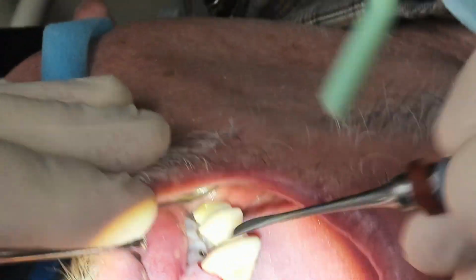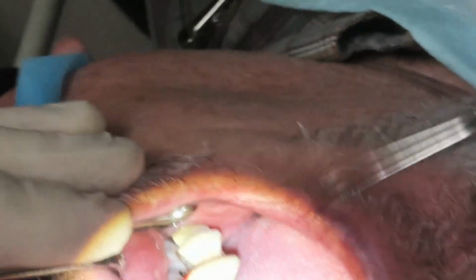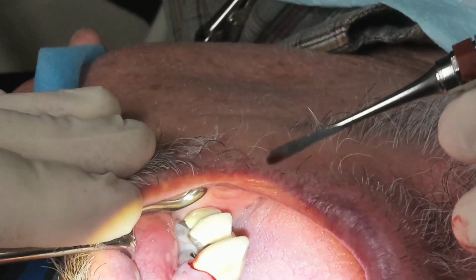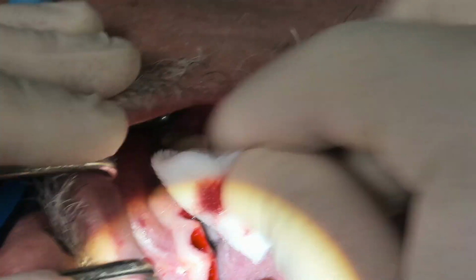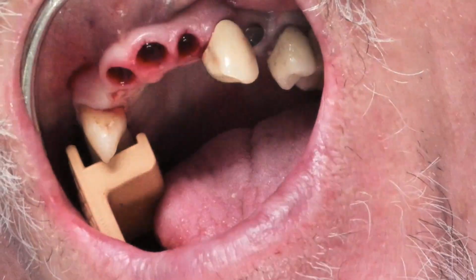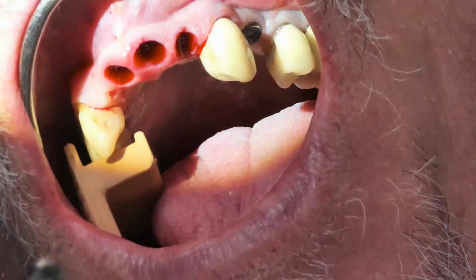So this canine, I don't know if you've seen all the x-rays pre-operative, but we'll show you, of course, later. And actually, this implant in the posterior is being restored by Dr. Jardine, who's here from Midwestern, in the room with us. And he has referred us the patient for today, so that your implant is going to be restored next coming week.